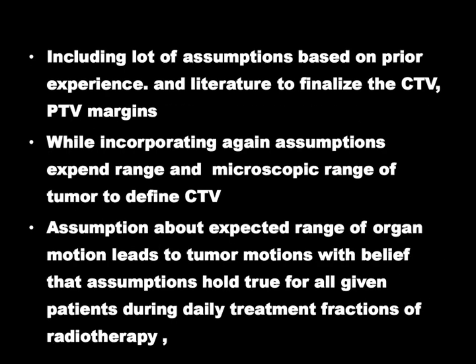So these are the allied portions of the machine. They help in the planning so that we can accurately delineate the tumor and the beam alignment is perfect, so that after acquiring the imaging, we can make corrections on the treatment planning system. Simultaneously or in between the treatment we can correct the image, or prior to the start of radiotherapy planning we can start correcting this.